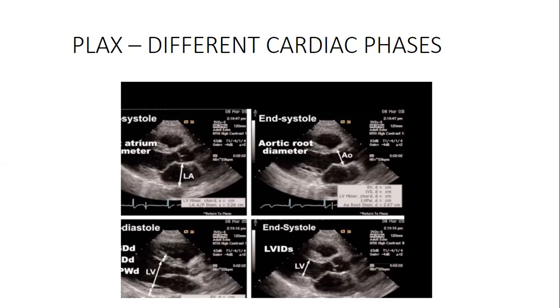Any contribution to that before we marry it with the Nyquist theory? Anyone who can comment on that? Okay, like she has said, the PRF is basically the number of pulses that are emitted in a second.